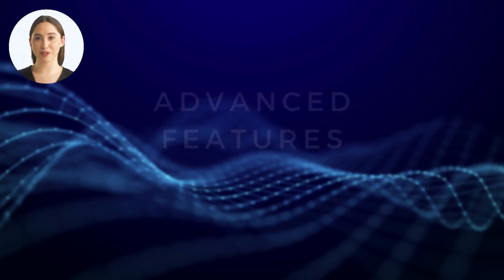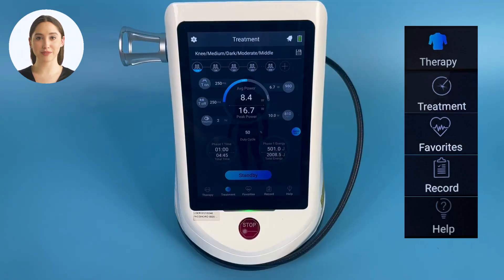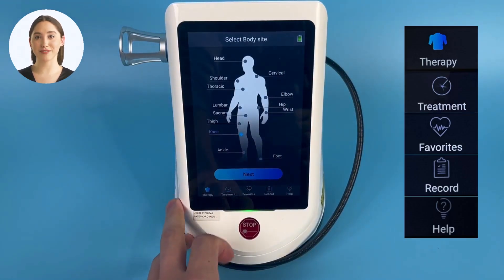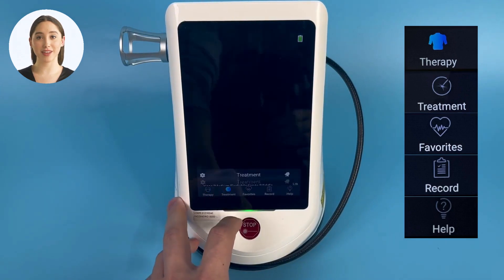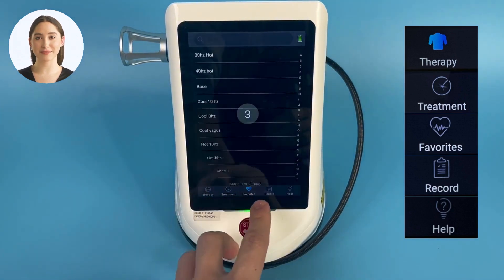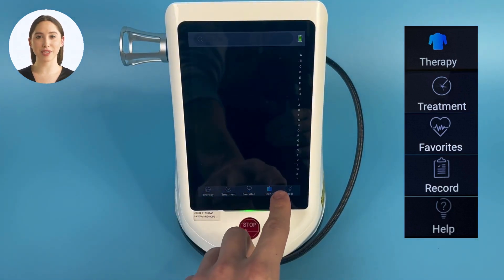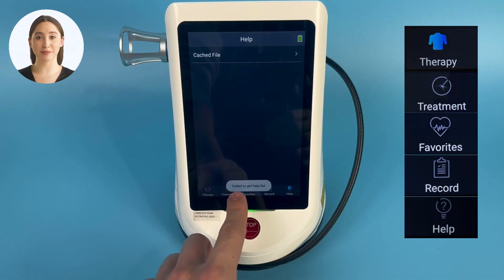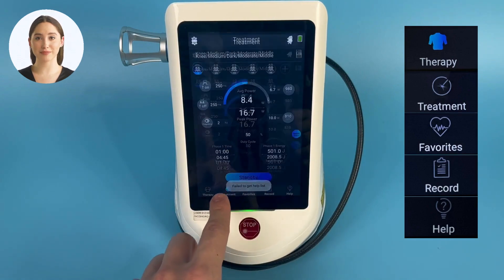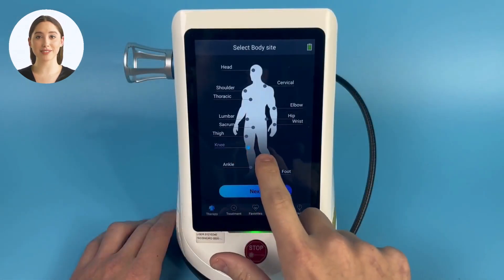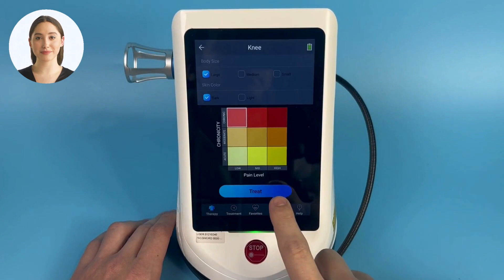We are now going to explore some of the advanced features and best practices with EVO. Let's start by familiarizing ourselves with the bottom menu icons. As you can see, we have therapy, treatment, favorites, records, and health. We seldom will use the last two, so let's focus on the first three.